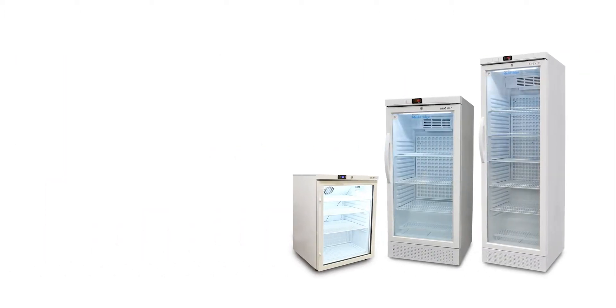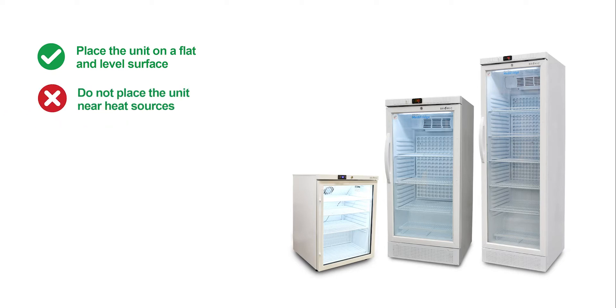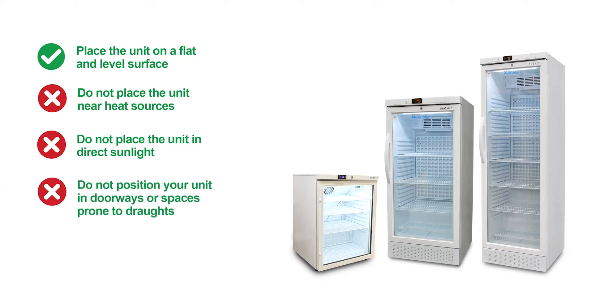Other points to note when positioning your unit: place the unit on a flat and level surface; do not place the unit near heat sources; do not place the unit in direct sunlight; do not position your unit in doorways or spaces prone to drafts; and allow adequate room for the fridge door to open unobstructed.